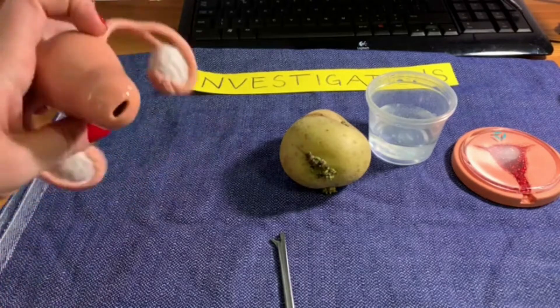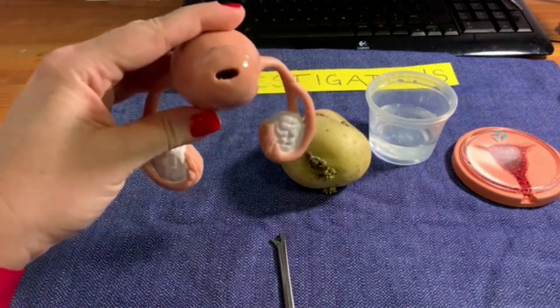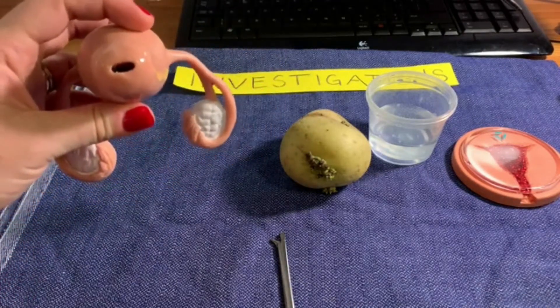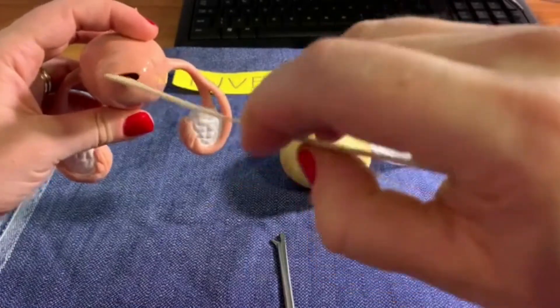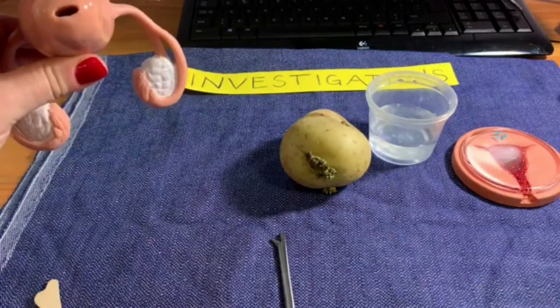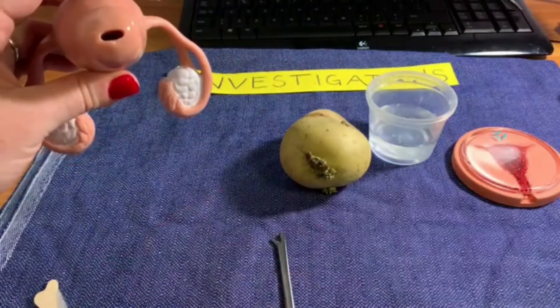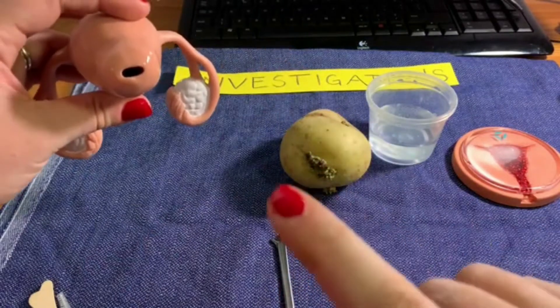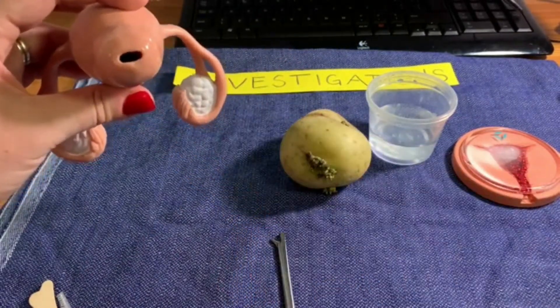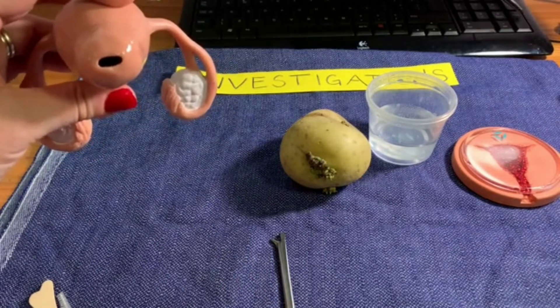Here we have a uterus with a normal-looking cervix. You will get a proper video and teaching on how to do a pap smear, but the important concept is that this cervix is completely normal. A pap smear is a screening test looking for microscopic abnormalities — you can't see any abnormality on the cervix, but that is what the pap smear is looking for.